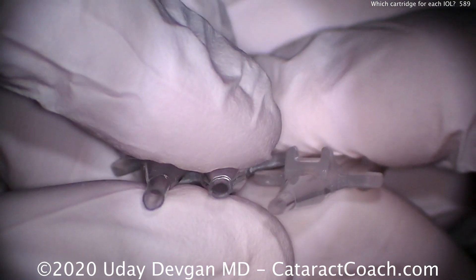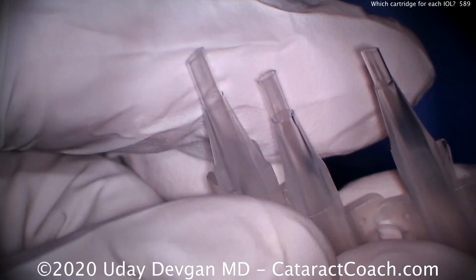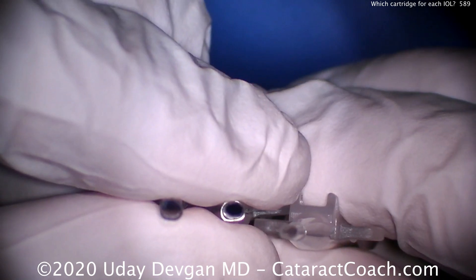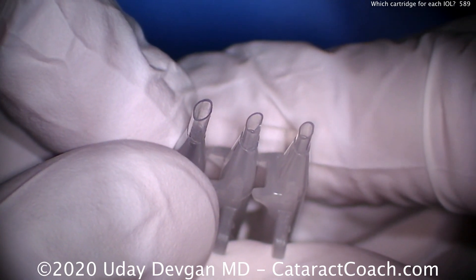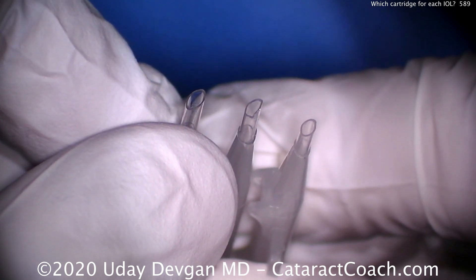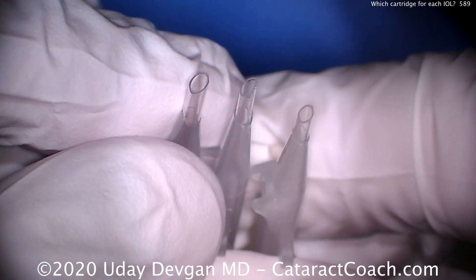The D cartridge is much tinier — look at the tips. As I line them up, you can see the tips are very different. The B is a lot bigger, the C cartridge is more compact, and the D is diminutive. That's my mnemonic for remembering these. And that also means they require different incision sizes for use in surgery.